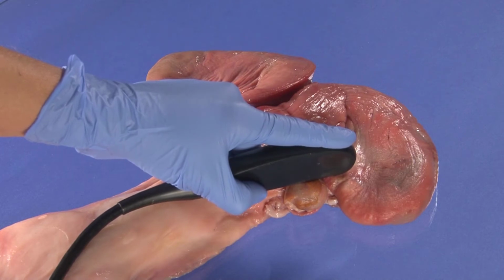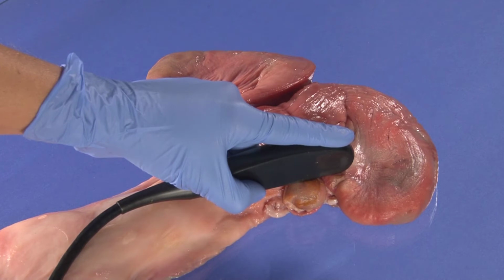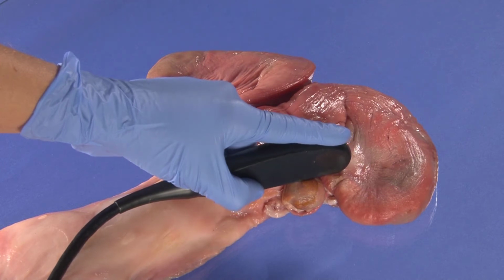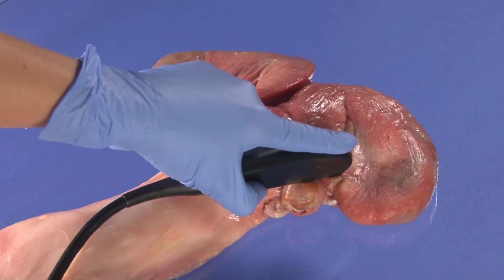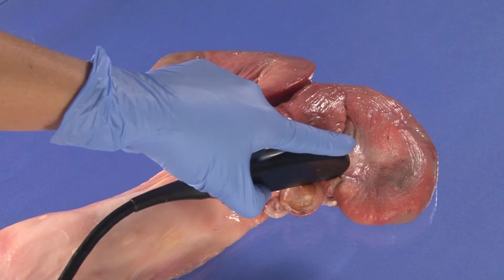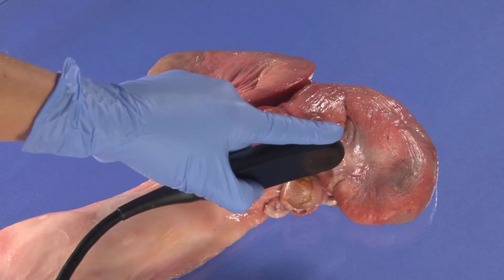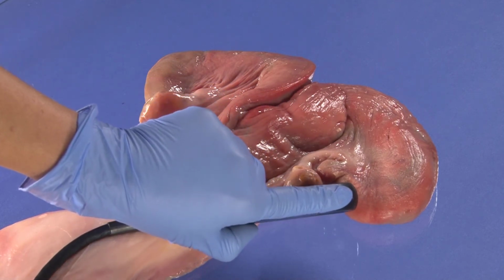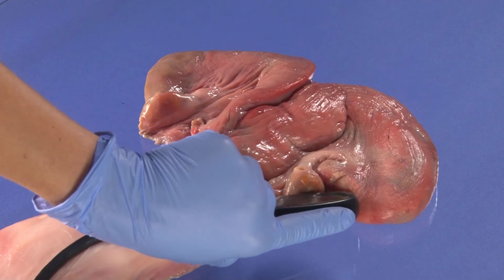Unlike the regular examination, you must stop using the scanning motion. Indeed, a scanning motion will cause artifacts as the Doppler identifies movement. Your movement or the blood's movement have no difference. Consequently, you must keep the probe over the CL and rotate it slightly. You must do this movement slowly to visualize the blood flow. If a CL has no blood flow, as for a D0, repeat the same movement with another angle to ensure you did not miss an important blood vessel.